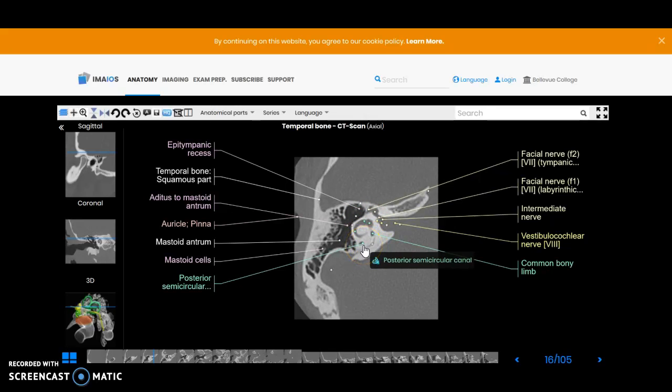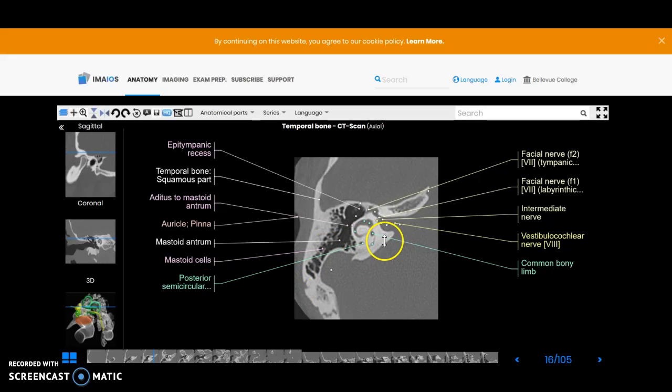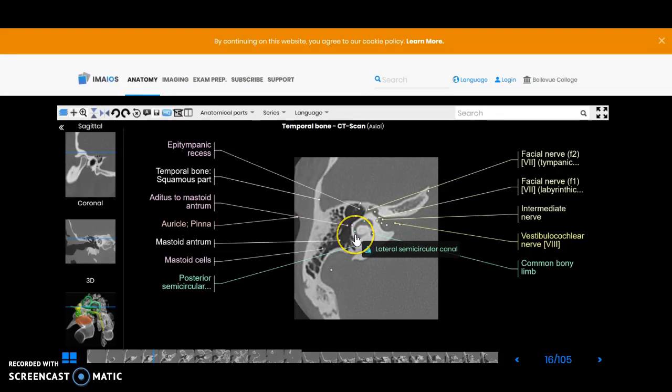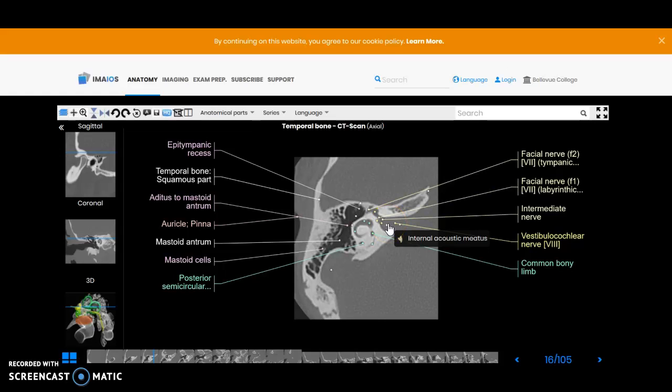As you hover on these you're going to be able to see the anatomy if it's not already up there. You can see the posterior semicircular canal here, you're just catching a little wisp of that, the lateral semicircular canal here, and then the internal acoustic meatus. They call it here in e-anatomy but sometimes it's called internal auditory meatus.